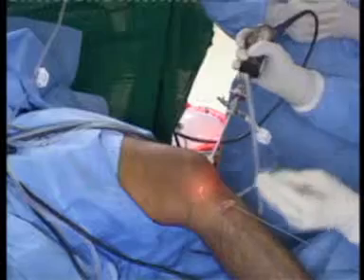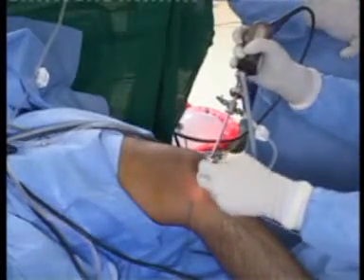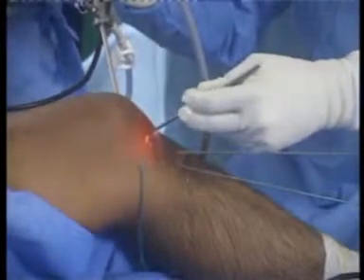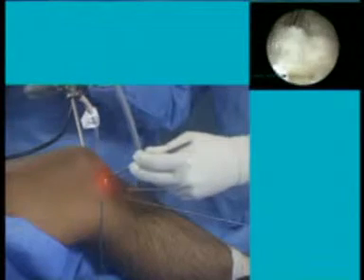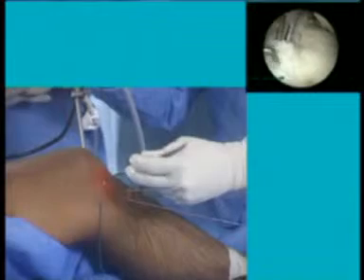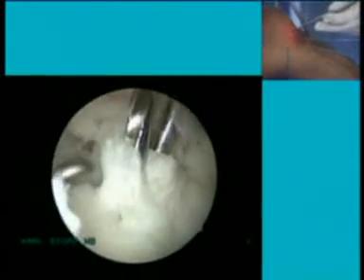You can see the divergence also in the intra-articular view, but of course we have a confluence in this case, but I think we are anatomically fine. This is the transverse meniscus ligament. Can we see the inside picture now? A small 25% outside and 75% inside. Lateral meniscus? 75% inside picture, please, camera person. Yes, thank you. Please continue, Dr. Peterson. So here you can see the old fibers.